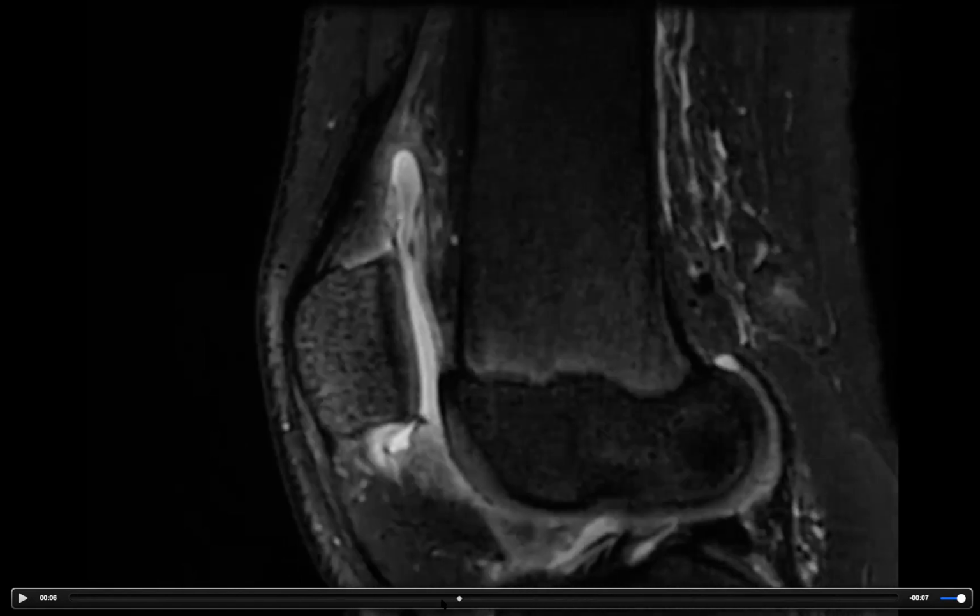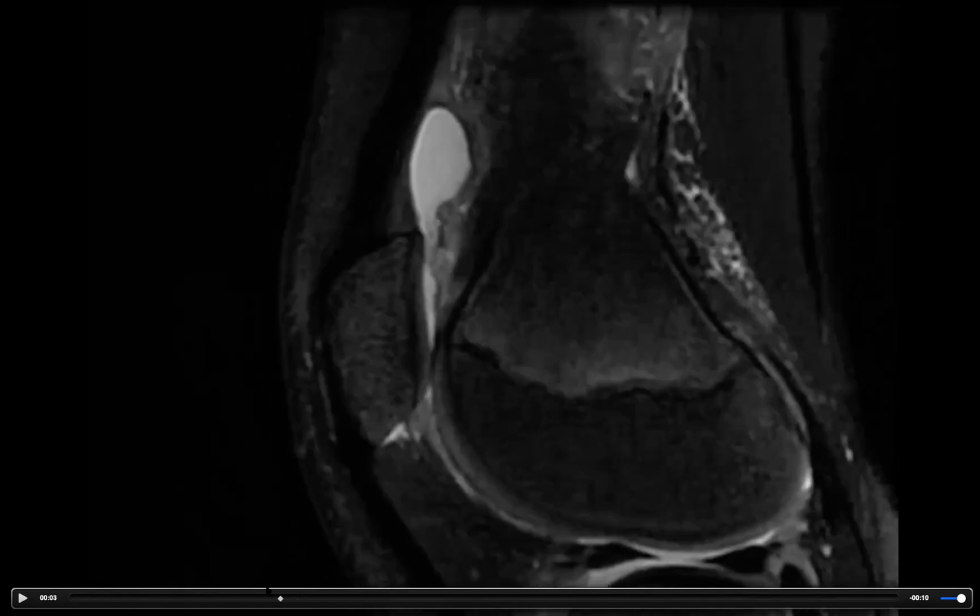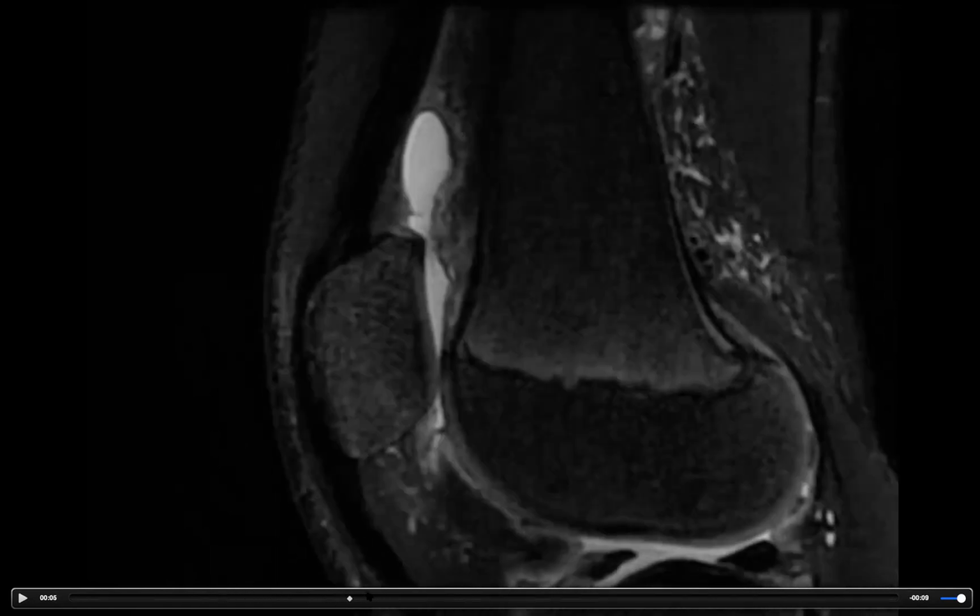And they're dark on MR because of the T2. Exactly. T2 is very short for them. And then this is a meniscus. You may have heard of people who have meniscal tears. So that's the meniscus that's there.